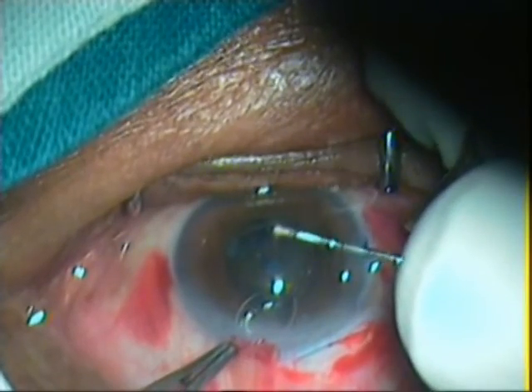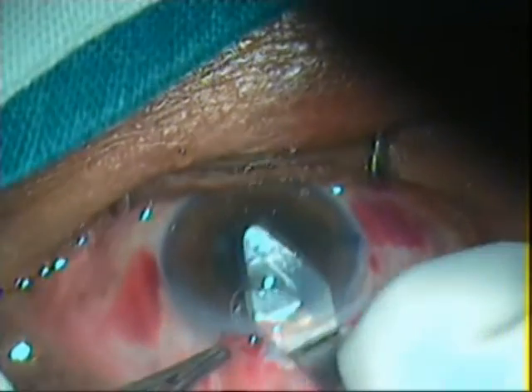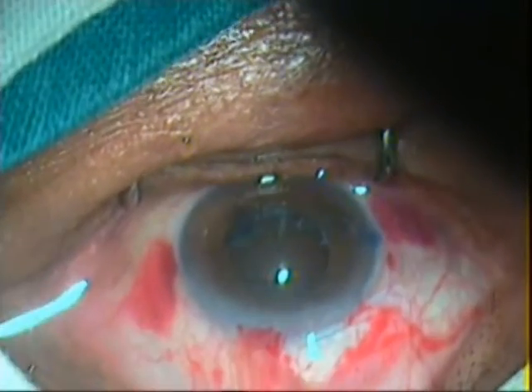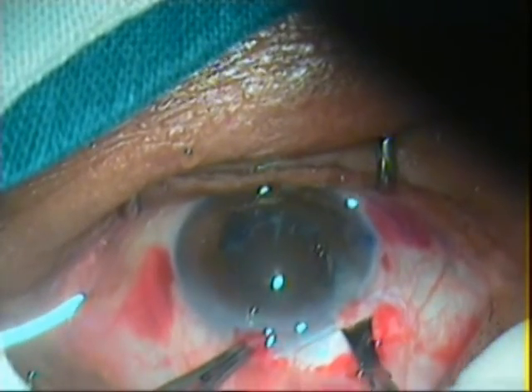Capsulorrhexis is made with a 26-gauge needle cystitome. The internal opening of the corneoscleral tunnel is enlarged to about 6.5 mm x 5.1 mm with a 2.8 mm keratome.